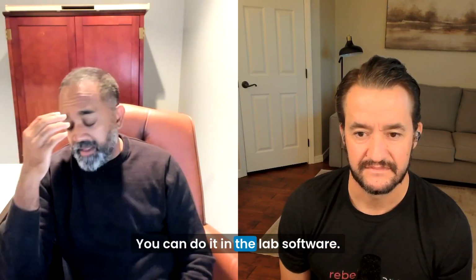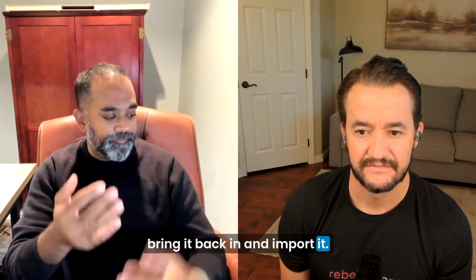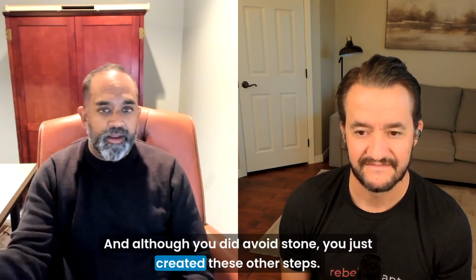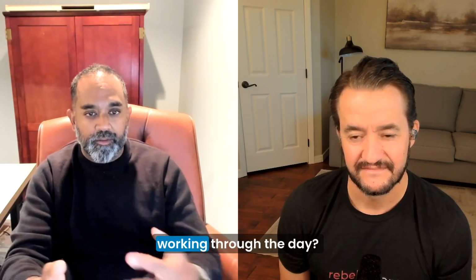You can do that in Mesh Mixer. You can do it in the lab softwares, and then you'd have to come out of the scanning software, go into some other software, flip it, bring it back in, and import it. And although you did avoid stone, you just created these other steps. And do those other steps make your life easier or harder when you're working through the day?